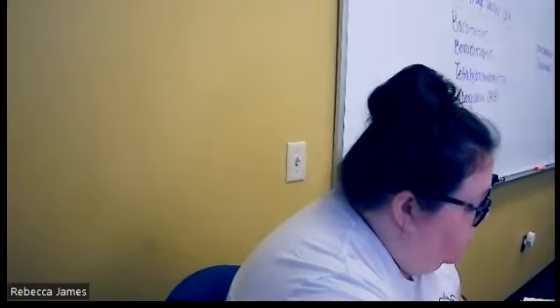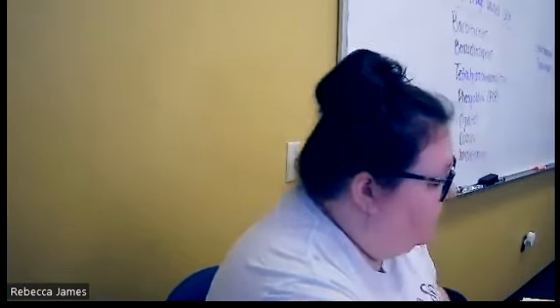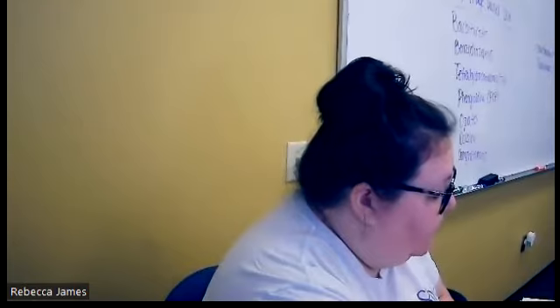Go down to the next paragraph. During gross examination, the color of the stool is also noted. A normal stool usually appears brown.